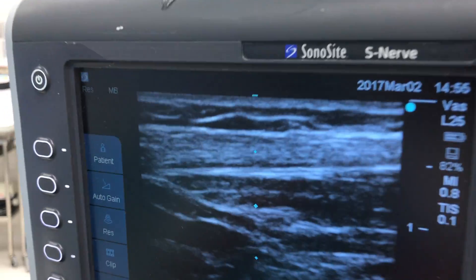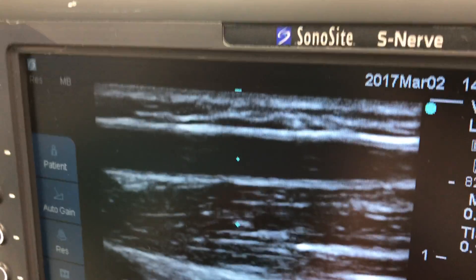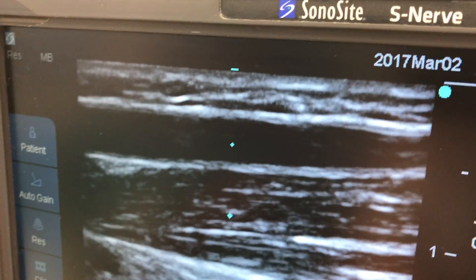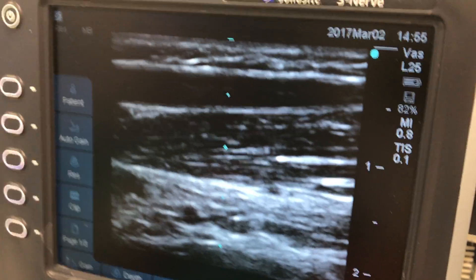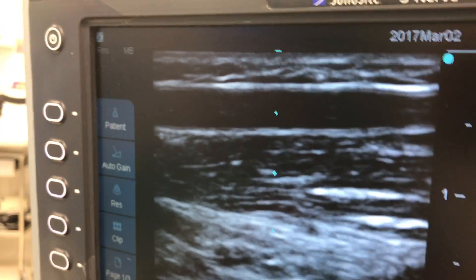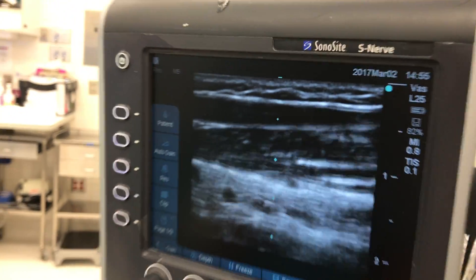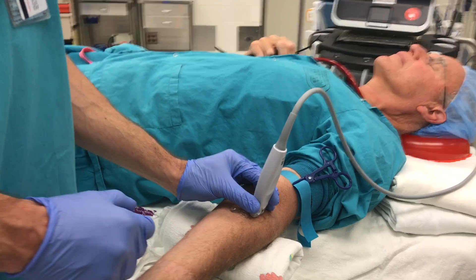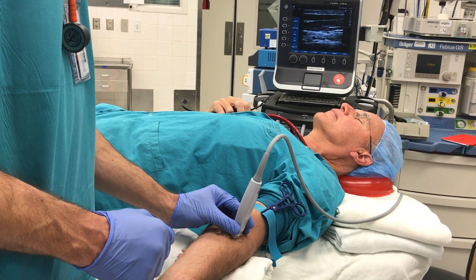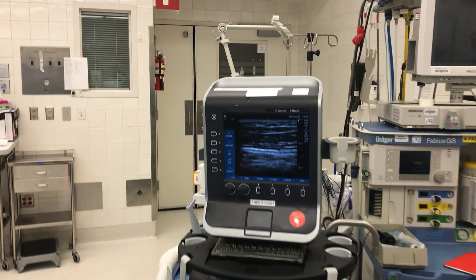Side to side — and you can see on the screen. You see that structure at the top of the image, with the very clear dark lumen and nicely defined edges. That's what the vein needs to look like. I can tell it's a vein because I can compress it. It needs to look like that with a really dark centre.